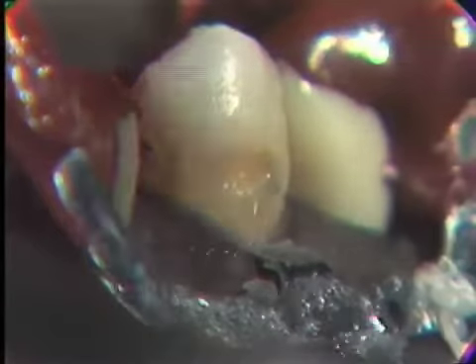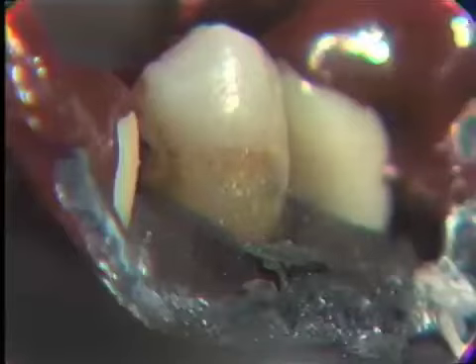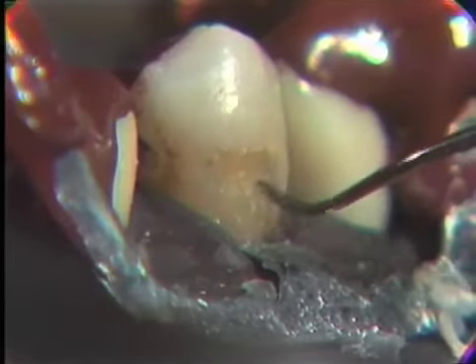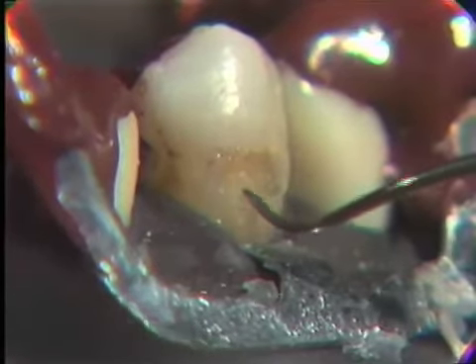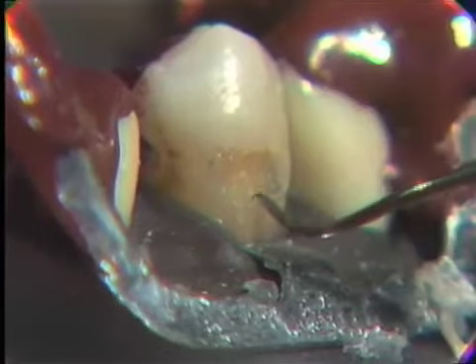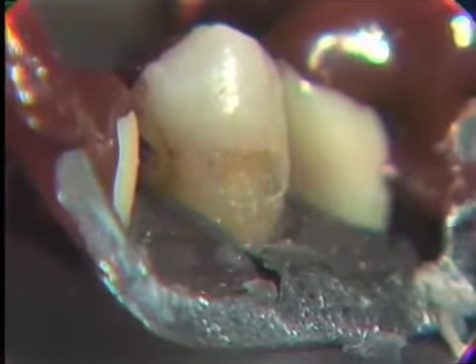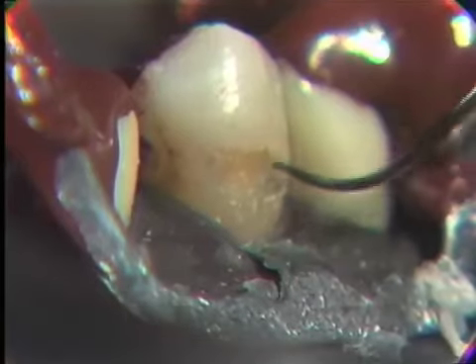Now we'll dry our cavity preparation off and observe our outline form. Now we'll do it visually and we'll do it tactilely. The use of a number 3 cow horn explorer is the instrument of choice. We're running our instrument along our margins to feel if there is any break in the continuity. And right here we feel along that cervical margin that there's a bit of a chip that we would like to get rid of. Now as we work ourselves over mesially, we find that we're quite smooth.